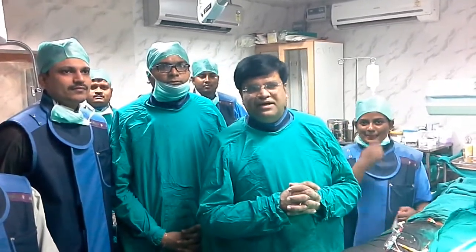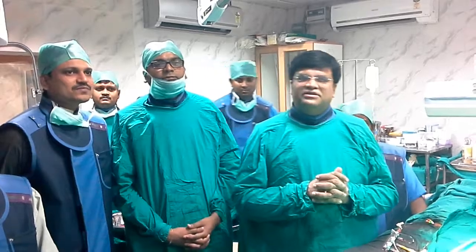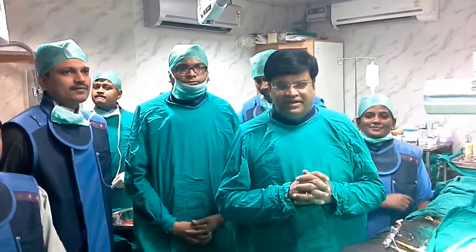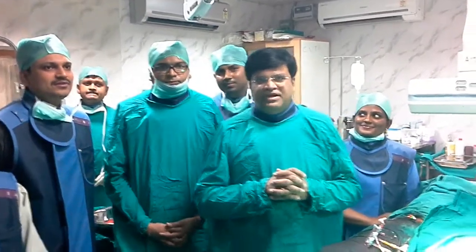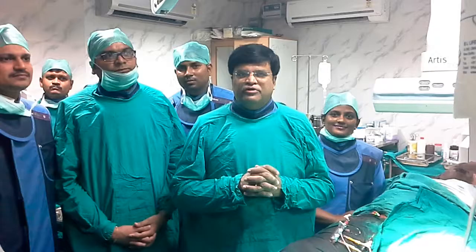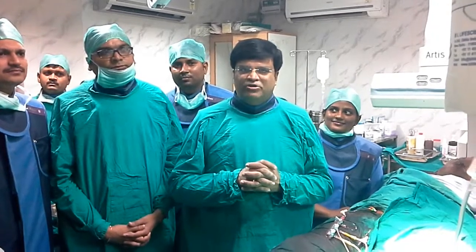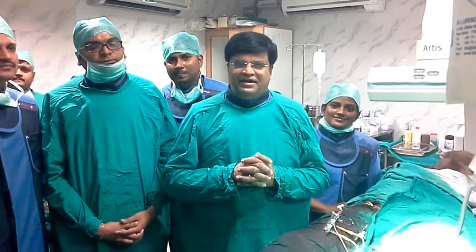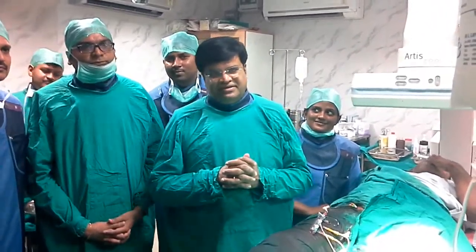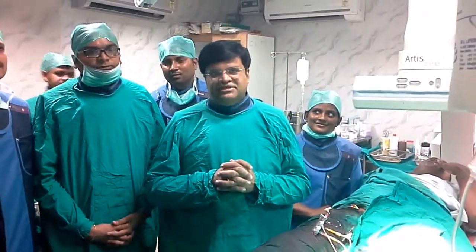I am Dr. Vivek Gupta. I am working as Senior International Cardiologist in Apollo Hospital Delhi. Today we have done a second Angioplasty Angiography Workshop at Saipai University. This is 20th of August 2016, Saturday.